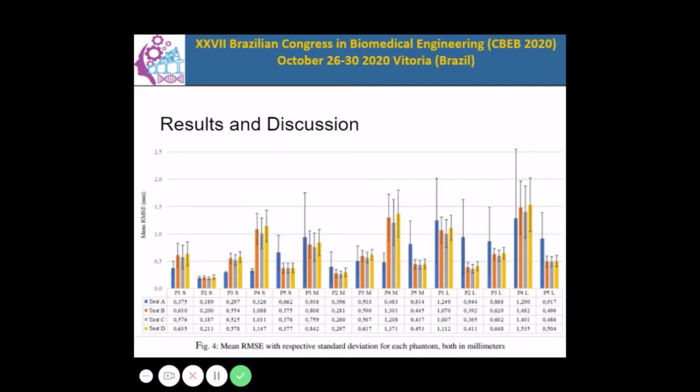In these cases, the mean error and Hausdorff distance are decreased by using the mirrored contour, which provides this curvature information. This fact is demonstrated by the increase of error for test A, which only uses information from the edges of the bone defect in the regression, in relation to the other tests as bone defect size increases.